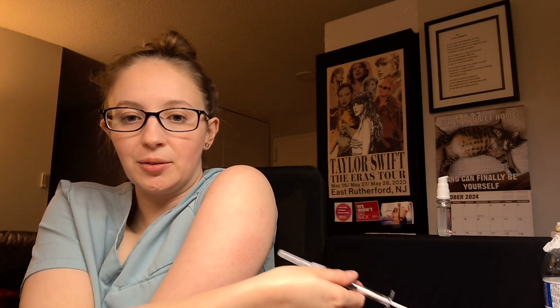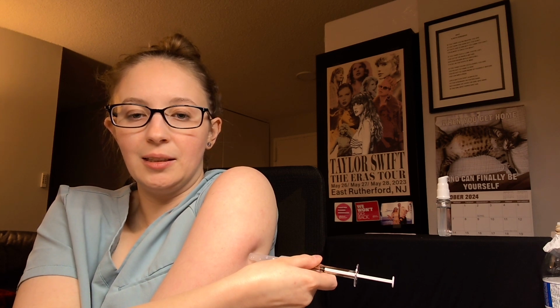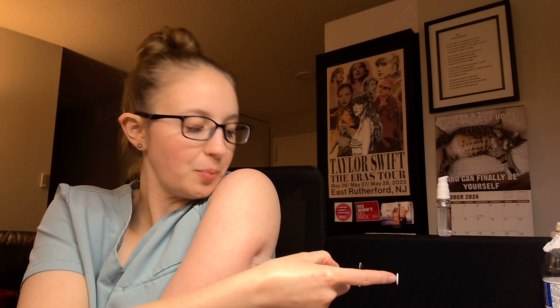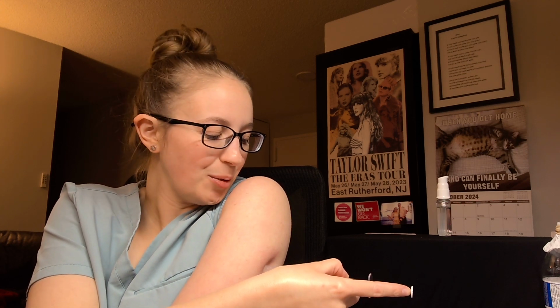So you're going to take your syringe and you're going to hold it almost like a dart, like this. And at a 90-degree angle, so straight in, you're going to push it into the skin. Once it's in the skin, you can go ahead and kind of just push your plunger back. So just push it back, and you're looking in the cylinder of the syringe. You're looking to see, is there any blood going in? That would mean that you hit a blood vessel. Very difficult to do with the subcutaneous, but we always double check. And if you don't see any blood, you go ahead and push that plunger down.